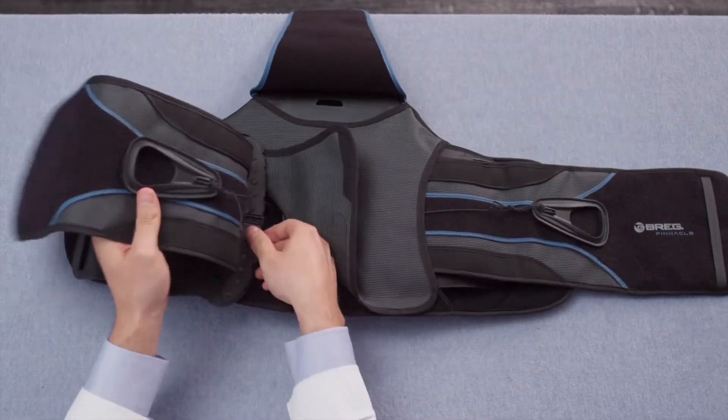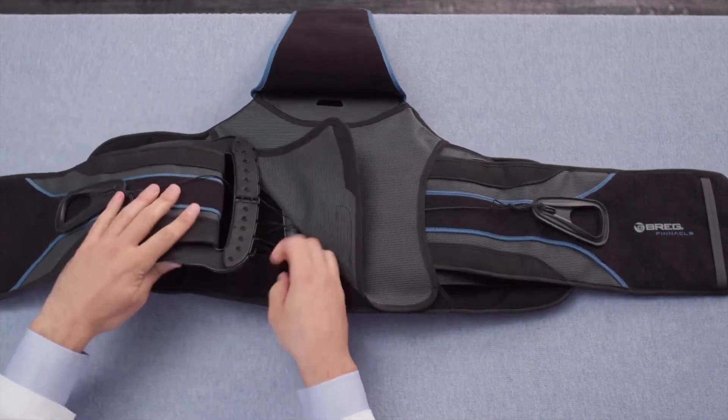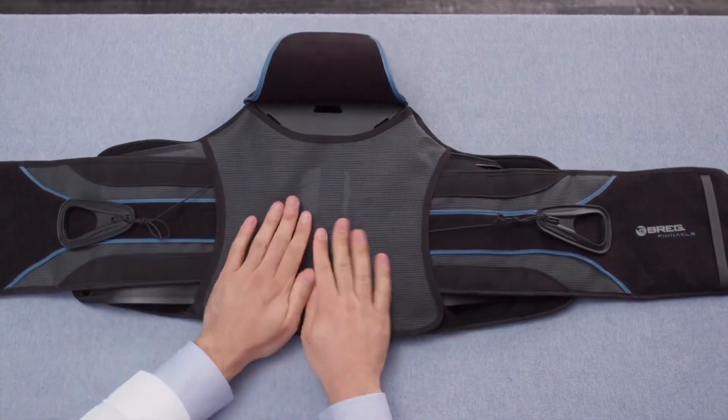Then lay this belt panel back where it originally was and close the back cover. Ensure that the back cover is pulled tightly as you engage the hook and loop at the bottom corner of the back cover.